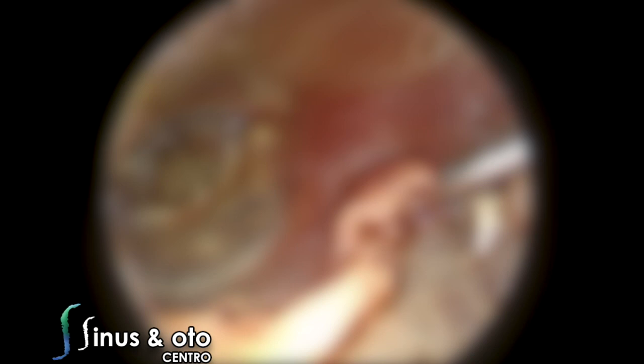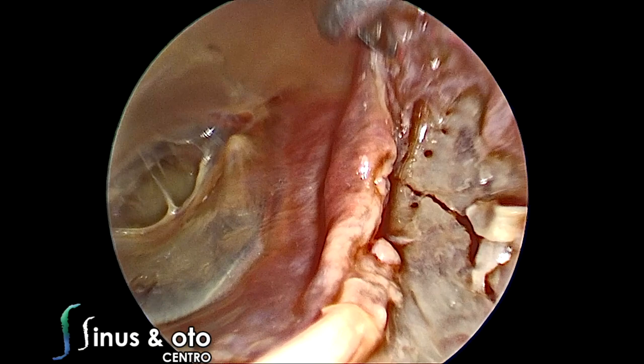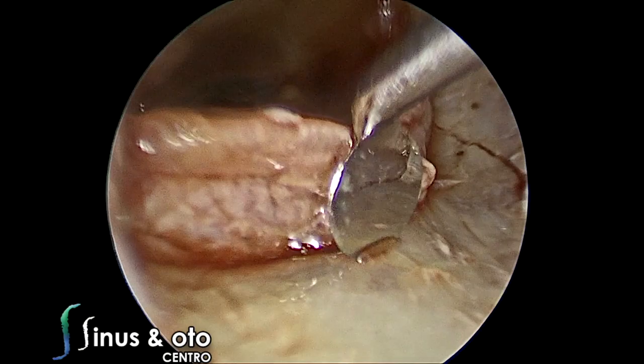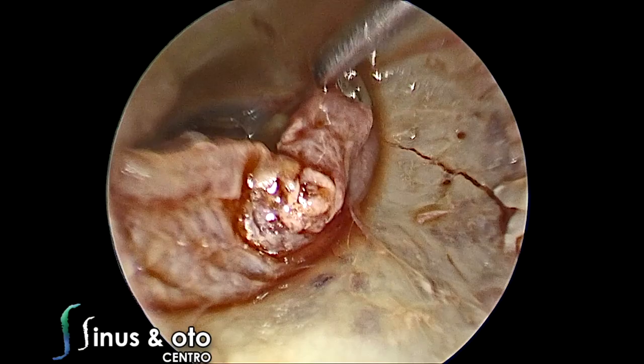The first step of our endoscopic dissection — I'm using a 30-degree, 3-millimeter, 14-centimeter length endoscope, 3 millimeters in diameter and 30-degree angulation — is to raise the tympanomeatal flap. This is a cadaver, of course, so it will not bleed.